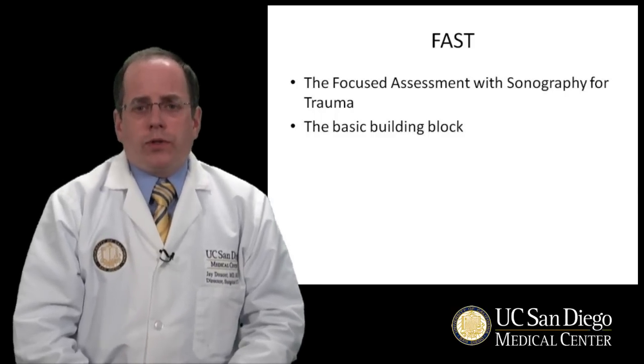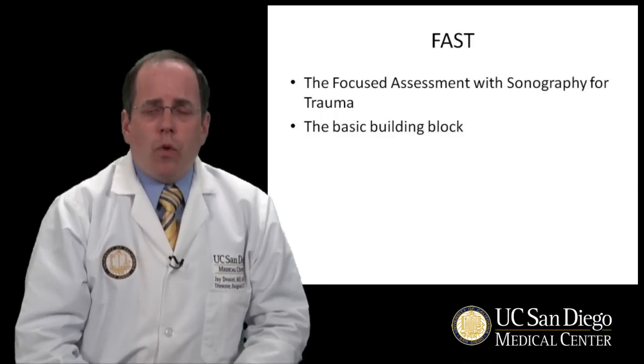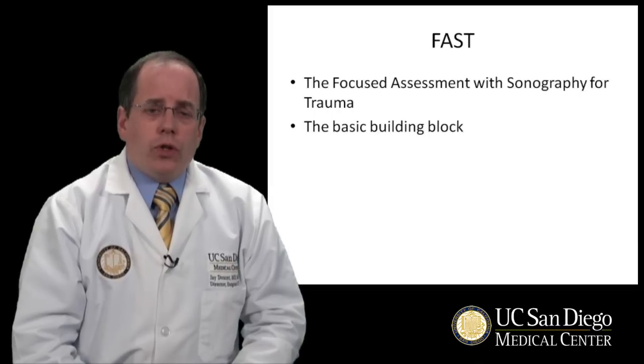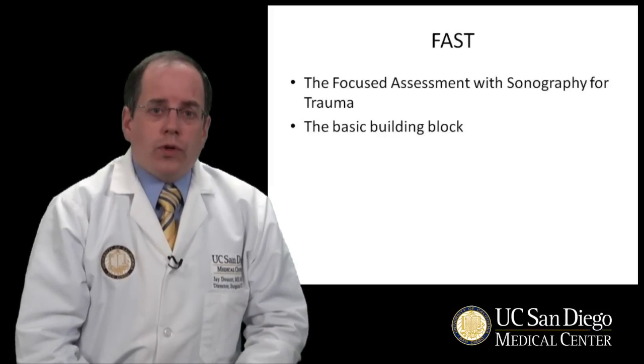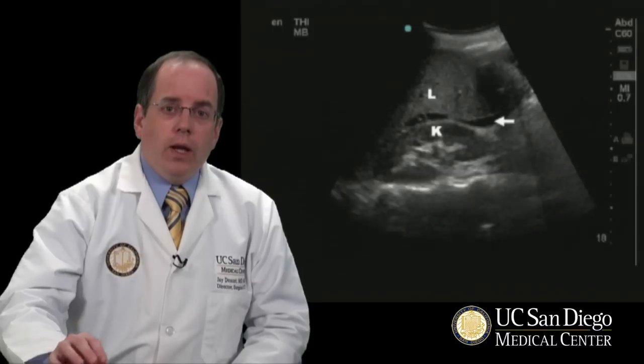FAST, or focused assessment with sonography in trauma, is the basic building block for training residents and surgeons for the use of ultrasound in the abdomen. It's a technique that should be learned by residents during the course of their general surgery residency. Here's an example of a FAST exam looking at Morrison's pouch, which is usually the first window examined. The L stands for liver and the K is for kidney. Between the liver and the kidney is Morrison's pouch, and normally you'll see the liver sliding over the kidney without any fluid present. However, in this ultrasound image, you'll see that there is in fact fluid sitting between the liver and the kidney. This would be considered a positive FAST exam for trauma.